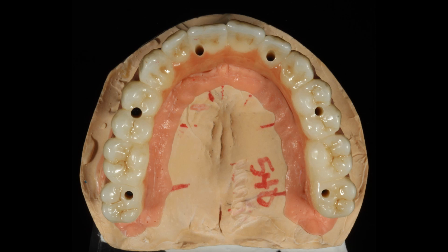Some things to note, how nicely spaced the implants are and how nicely angled the implants are. All of the screw holes come through the teeth without any angle correction, and that's done through abutments. If you've seen any of my other videos, you'll know how much I dislike those and how bad they are for the long-term success of the case.